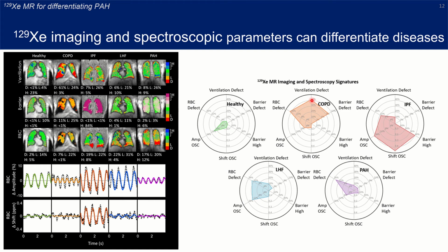So how can we apply this technology? Being in a pulmonary hypertension clinic, frequently we end up seeing patients who are dyspneic or short of breath, and it's really unclear why, and we have to figure it out.